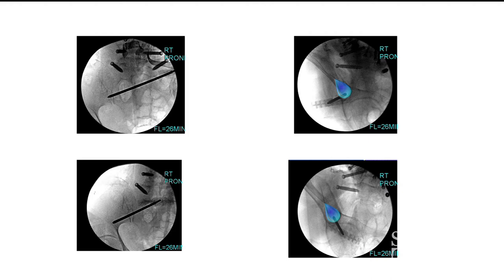Once you advance, you get very easily into the teardrop, but there is a difference: you're getting into the bottom of the teardrop and then working up superiorly from the inferior part of the teardrop going way up. This is a little bit different from what we saw with the other two open techniques.